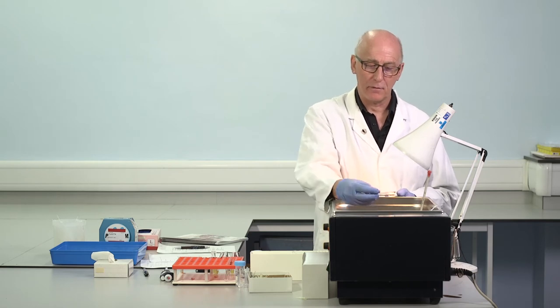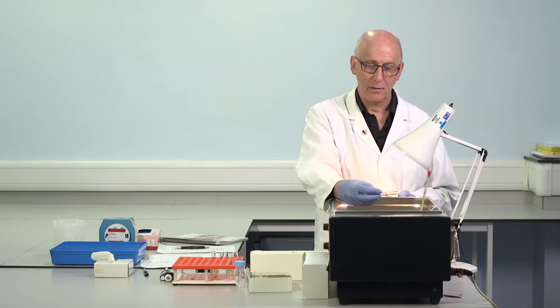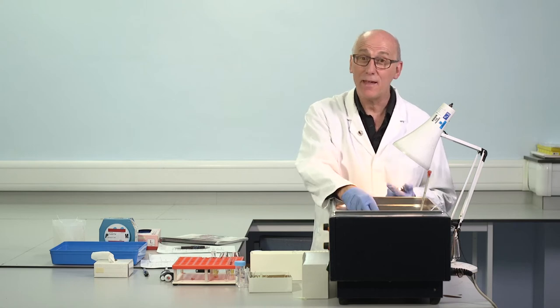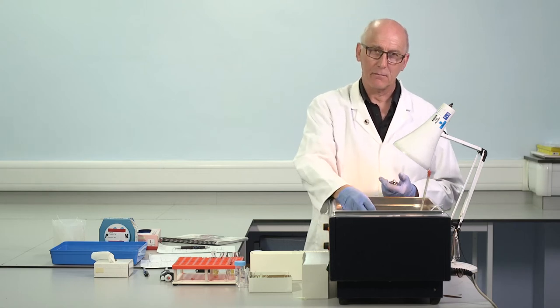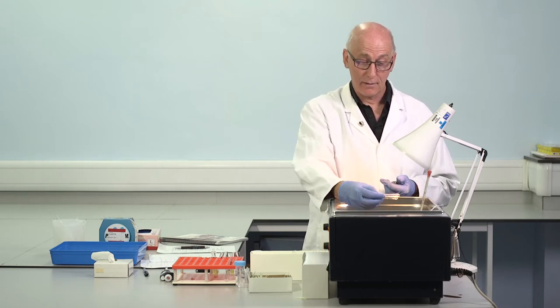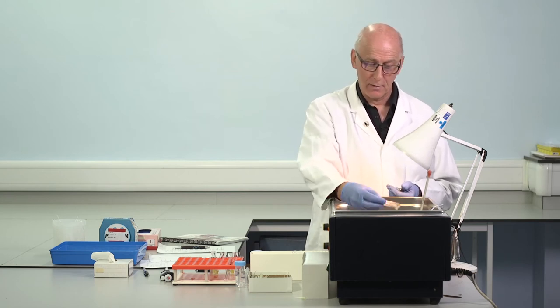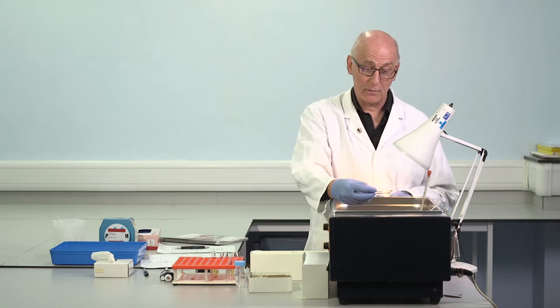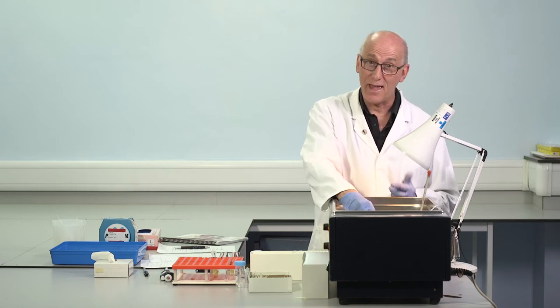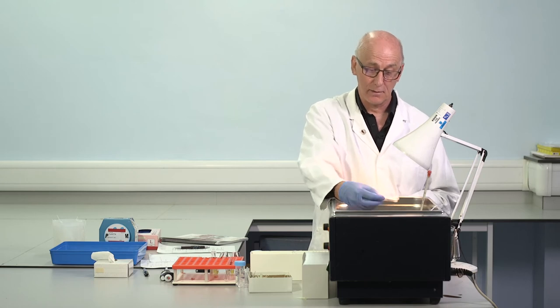If we make the mixture of normal plasma and patient sample, and we make an APTT on this, and it remains grossly prolonged, that would mean adding the normal clotting factors hasn't improved the APTT. It's not been corrected, it's remained grossly prolonged. In this case, we can be very confident that something is interfering, inhibiting the reactions. We don't know yet the nature of this inhibitor, but it's a strong suggestion that an inhibitor is present.